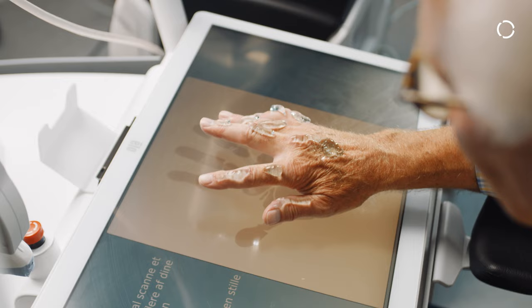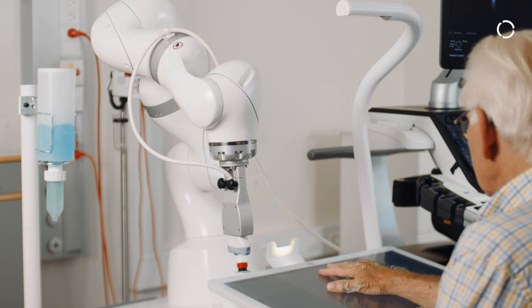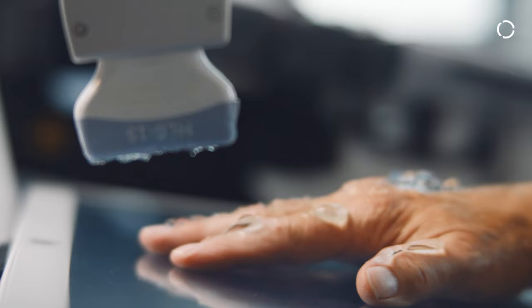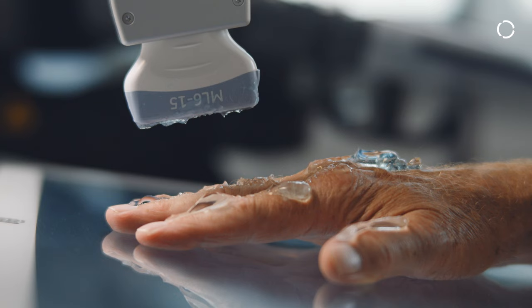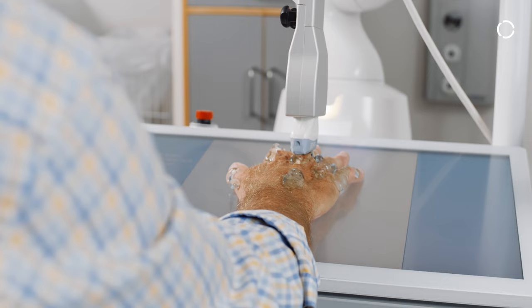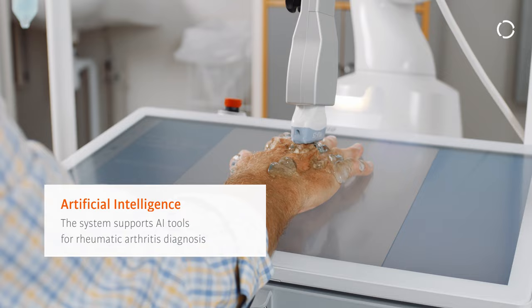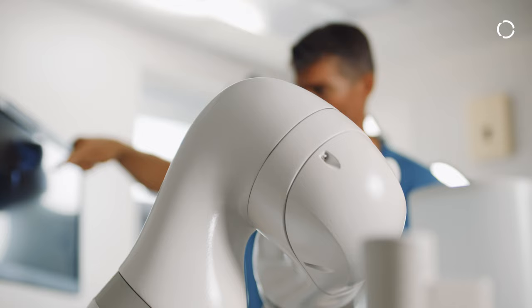Our camera system automatically identifies the joints in their hand. These positions are sent to the robot, which moves above the position, lands softly on the joint, and then searches for the right plane in the ultrasound image to take pictures. These are transferred to our AI, which estimates disease activity in each single joint.